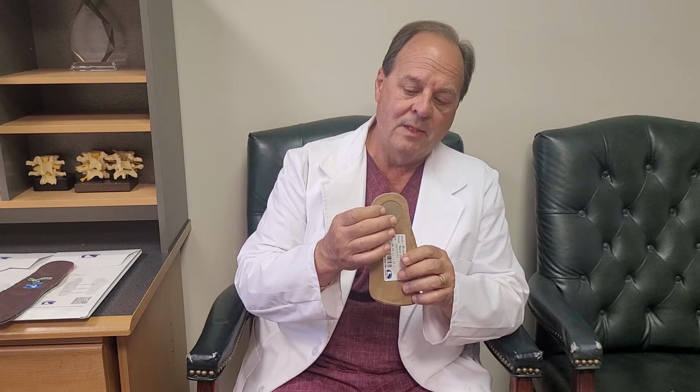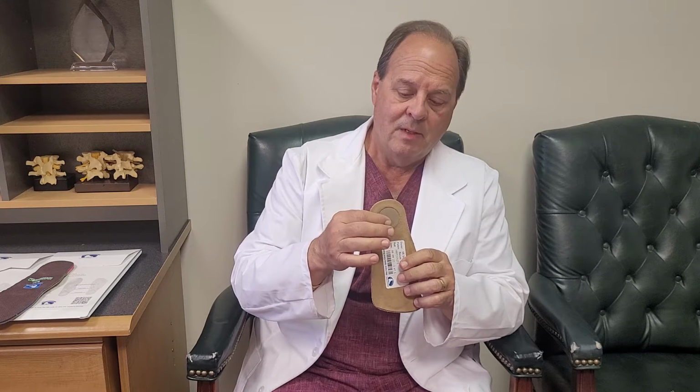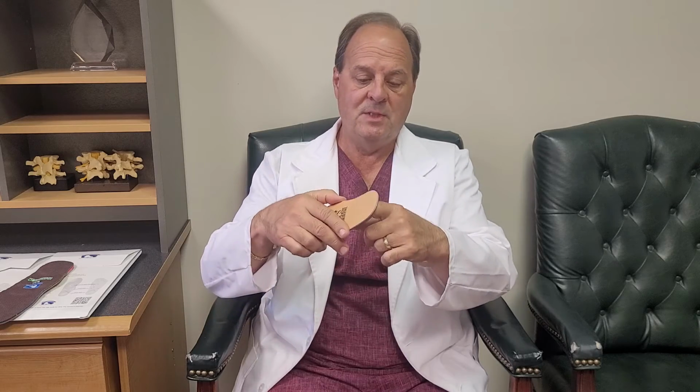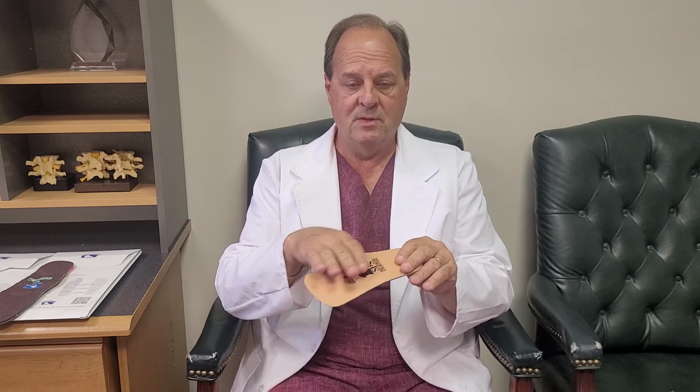Also, on the bottom of the orthotic, you'll see most likely a little Velcro tab. The other part of the Velcro will be in the box. What that means is you can take the Velcro tab and stick it to the bottom of the shoe. If the orthotic is sliding around in the shoe, maybe it's a low heel, or it's just one of those shoes that's kind of slippery inside and the orthotic doesn't want to stay in place, you can use that Velcro tab to anchor it down into the back of the shoe.